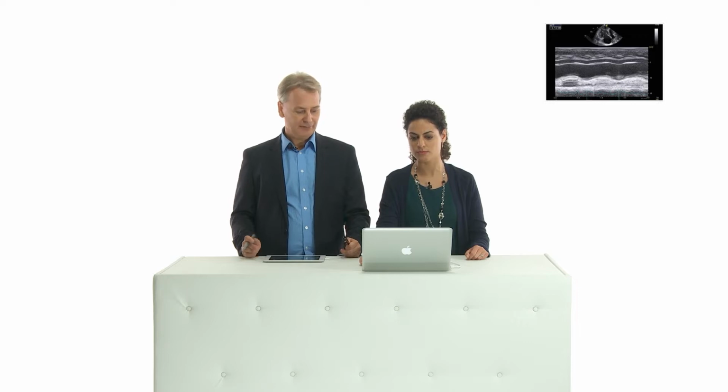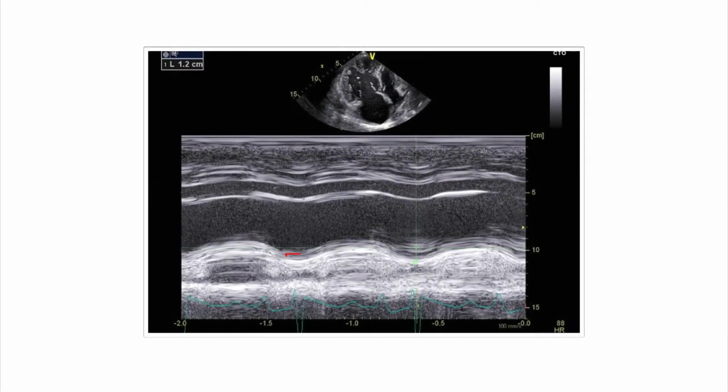And here's an example of a patient who has a reduced TAPSE. You see that these excursions are much less. Again, we'll measure from here to here, and the value is definitely below 16. An example of a patient with reduced right ventricular function. It's a nice way of looking at it.